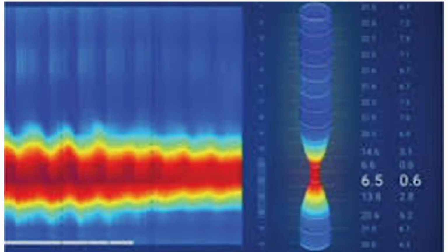This is the picture of the EndoFLIP, which is used to assess esophageal distensibility and diameter. So the left panel is the diameter or the CSA topography plot over time, where the x-axis is the time and the y-axis gives the position along the balloon from the esophagus to the EGJ.